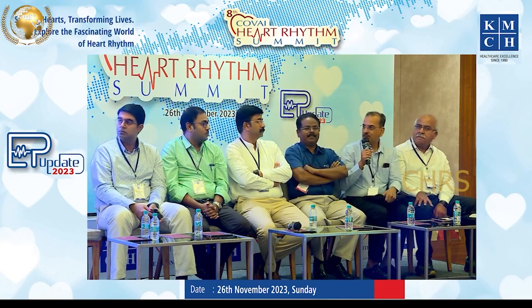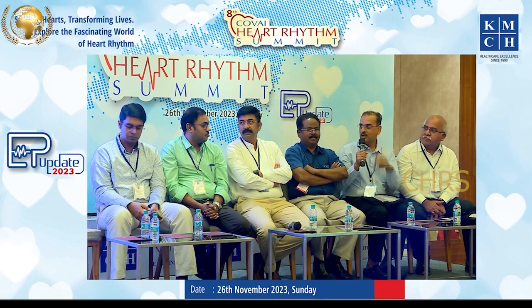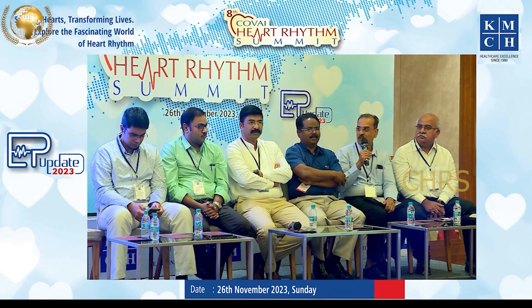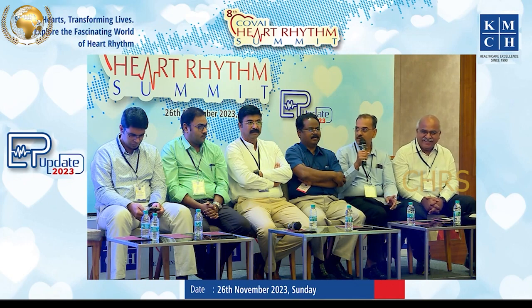The first slide, I think you have put 60% sensitivity? Yes, sir. That's the most important point: don't trust the ECG alone. The history has got to be the most important, the risk factors, what kind of presentation it is, and serial ECGs.